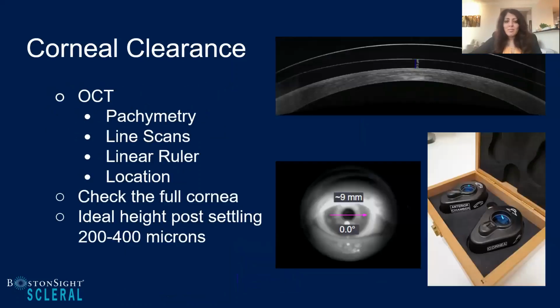And then once I got my OCT, that was really the game changer for me, because now it wasn't so much guessing and using these estimates. I had a very, very specific tool for me to be able to make these exact measurements. With the OCT, we can have these beautiful diagrams of what the cornea looks like, what that scleral space is, what the scleral size is, and we can use these rulers to actually take these measurements, which is fantastic.